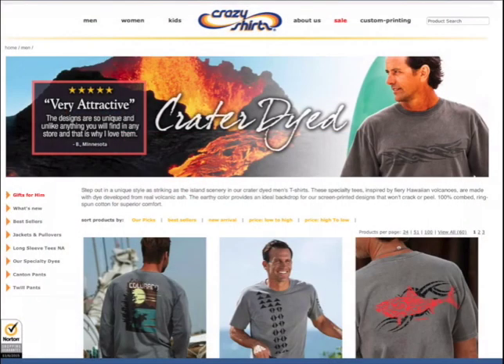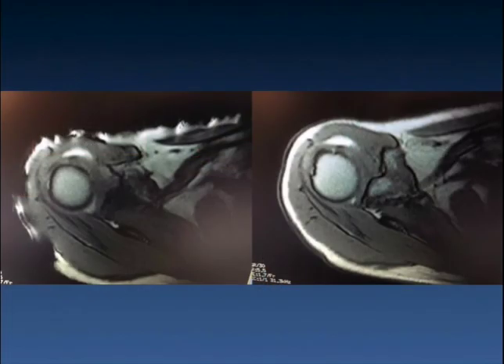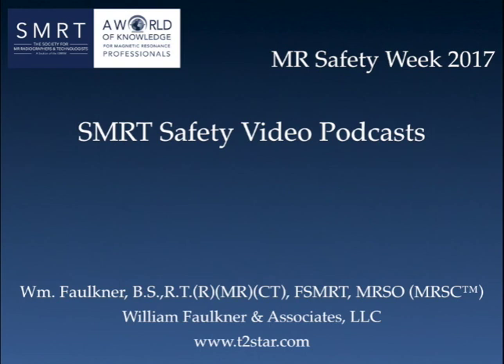Even just plain T-shirts. Somebody sent me an example of this. I went and looked it up online, and this company makes T-shirts where the ink is created from volcanic ash. And here's an example on the left of a patient wearing such a T-shirt, and then on the right, once they have removed the T-shirt. So again, this is just a few little things to think about during MR Safety Week.